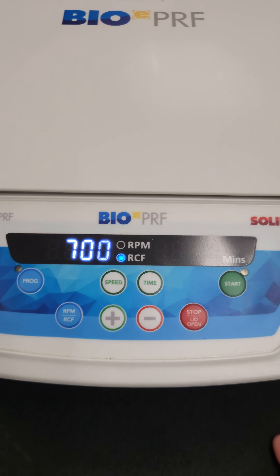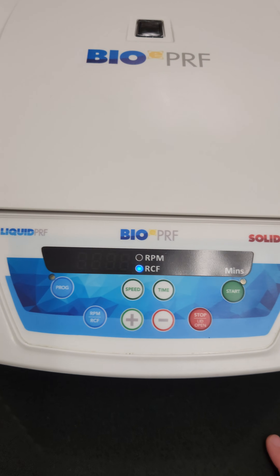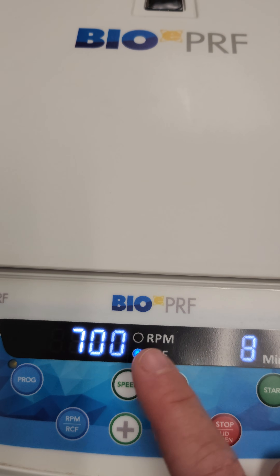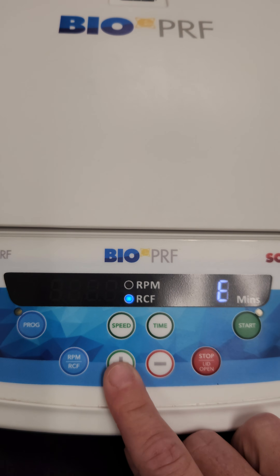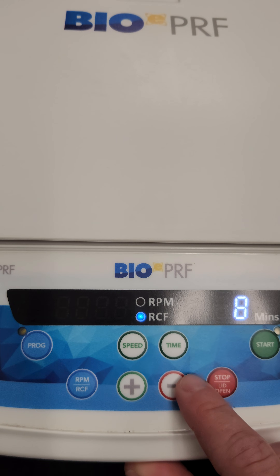As you'll see, ours as soon as it's turned on is already set to 700 RCF for eight minutes. If you want to change any of the settings you're going to do so here. All you have to do is click on speed and then you can hit the plus or minus button to change the speed.